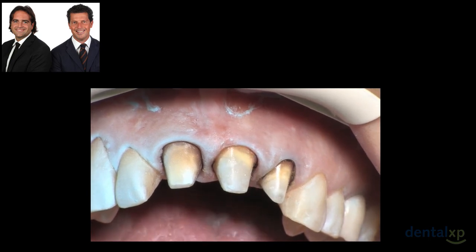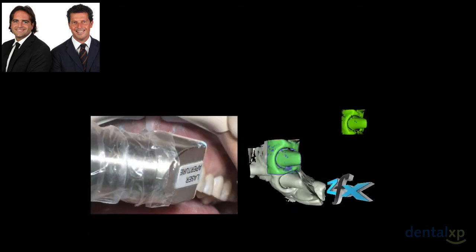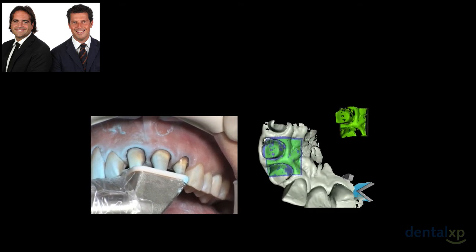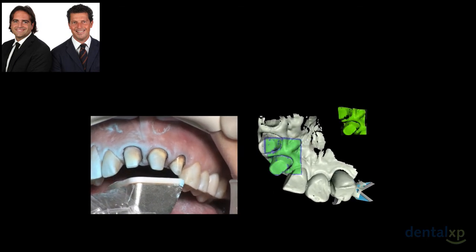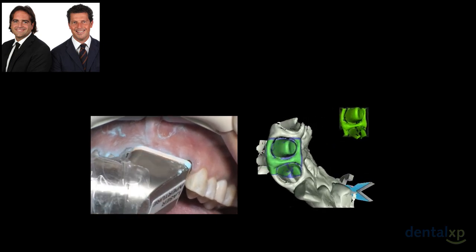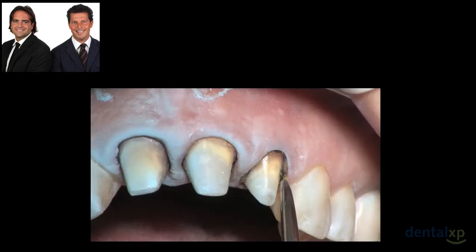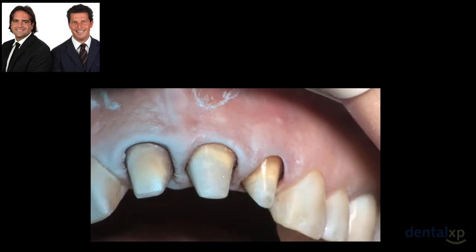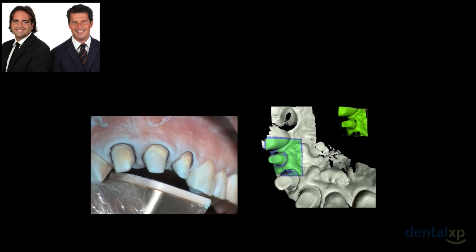Once we are done with the first abutment, we can take out the second cord, placing again very little powder and starting our second abutment scan. And you see the software is overlapping it together with the first scannerization in real time, and we have the 3D model that is generating. You can see some black holes that are gonna become gray right now. The movements are very slow. Clinically, you have to be patient, and when you're happy with it, you can take out the last cord, sorry, the second cord of number 10, and again start scannerization.